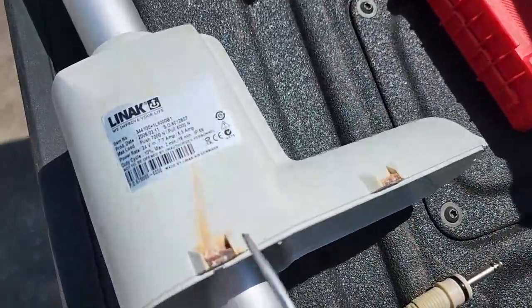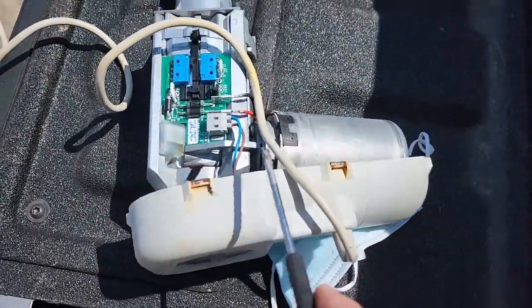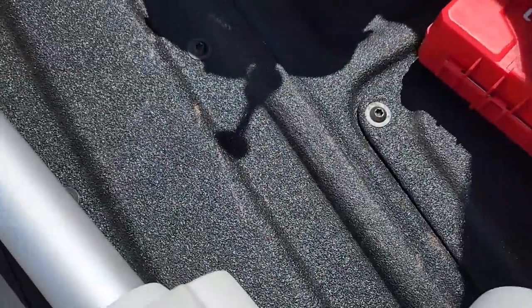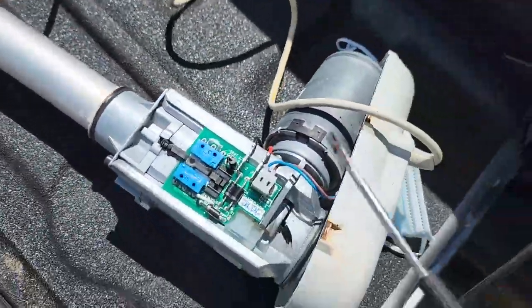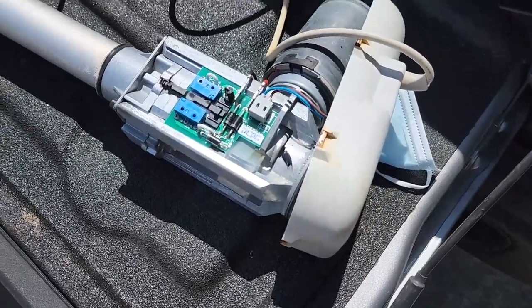These linear actuators, you can see they got these clips. They go around the perimeter of the shell. All you gotta do is pop these clips off with a little flat blade screwdriver and you can get into the guts. Now the symptoms for this particular device were that it would go up, but it wouldn't go down.